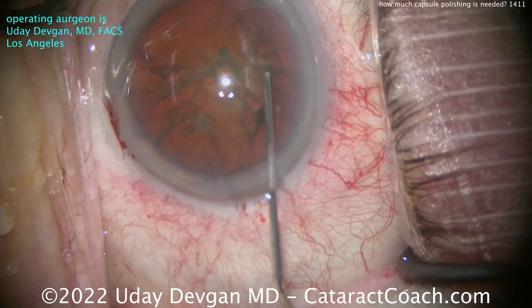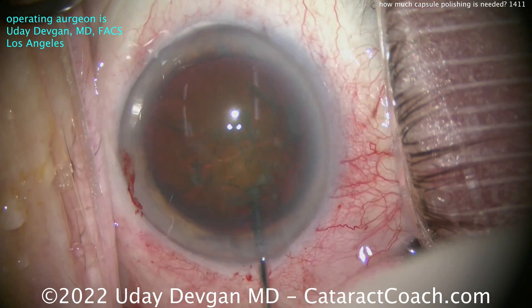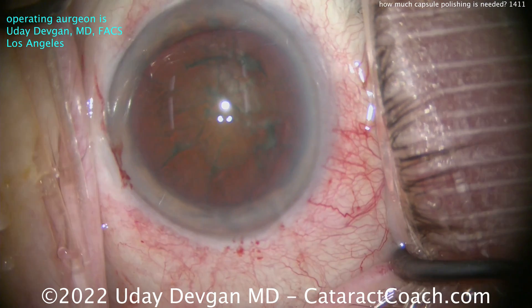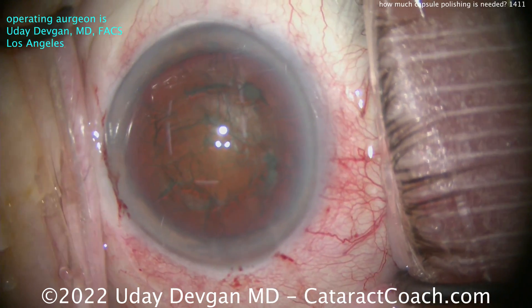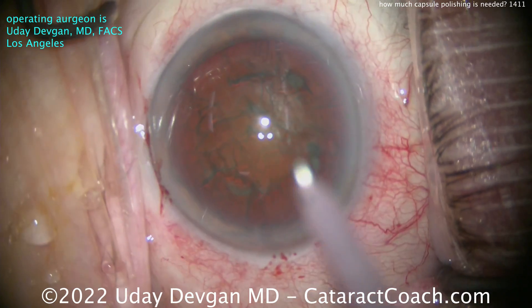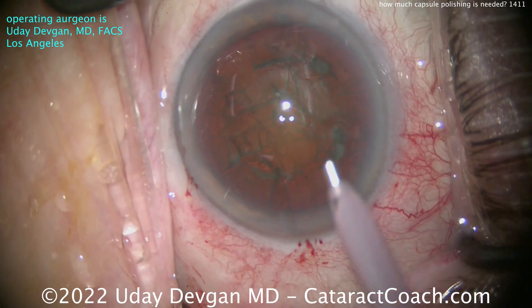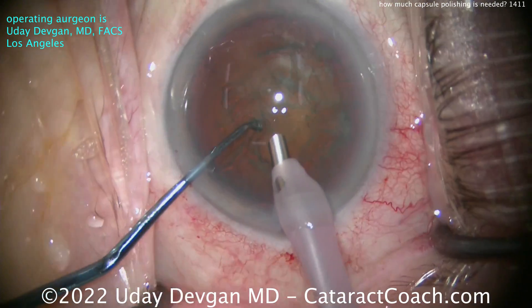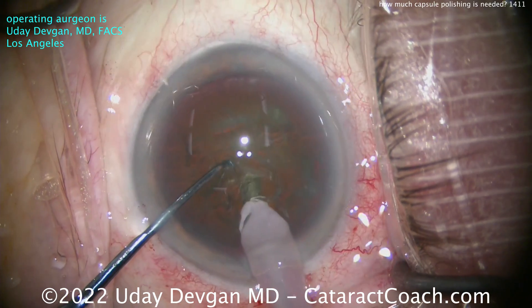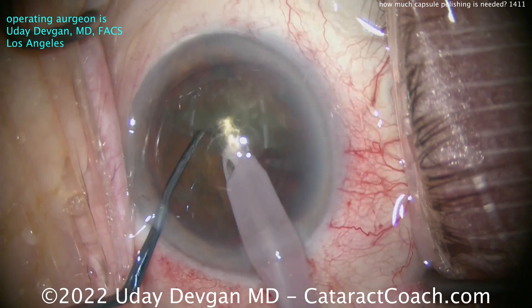I'm expecting some pretty reasonable nuclear density here just given the patient's age of 94. In the preoperative measurements, the lens had a very large thickness of about 4.8mm anterior to posterior dimensions of this crystalline lens cataract. A little bit of hydrodissection, a little bit more protection of the endothelium — of course when you're 94, the endothelial cell count may not be all that high. Going in with the phacoprobe beveled down, let's get some chop action. Phacoprobe into the nucleus, chopper going in — a combo chop to split that nucleus into two halves.